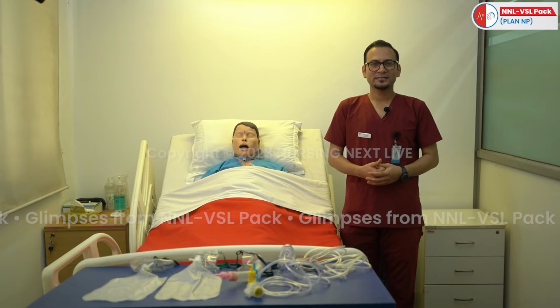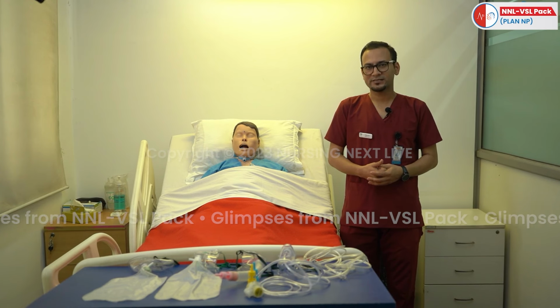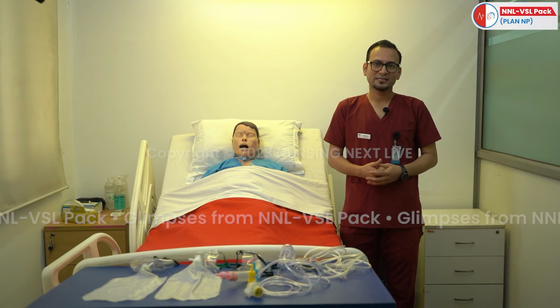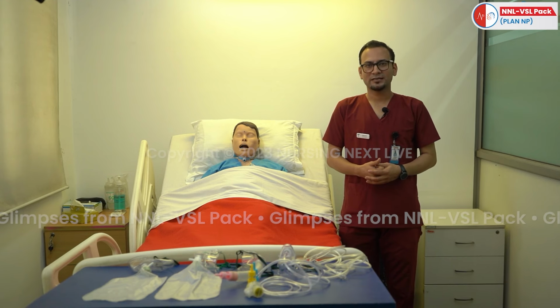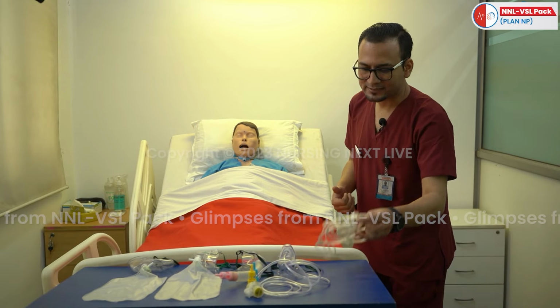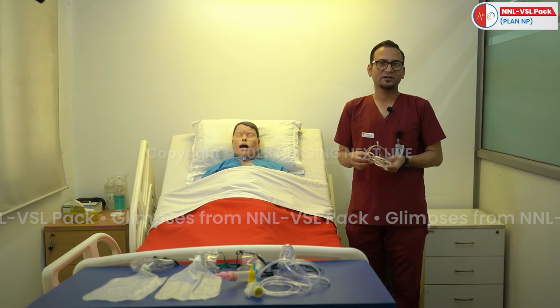So first, we'll discuss the low flow oxygen devices. There are two low flow oxygen devices we commonly use in hospital settings. First is the nasal prongs or nasal cannula and second is the simple face mask. So first, we'll discuss the nasal cannula or nasal prong. Nasal cannula or nasal prong is the easiest and simplest way of delivering oxygen to the patient who is having a respiratory difficulty.